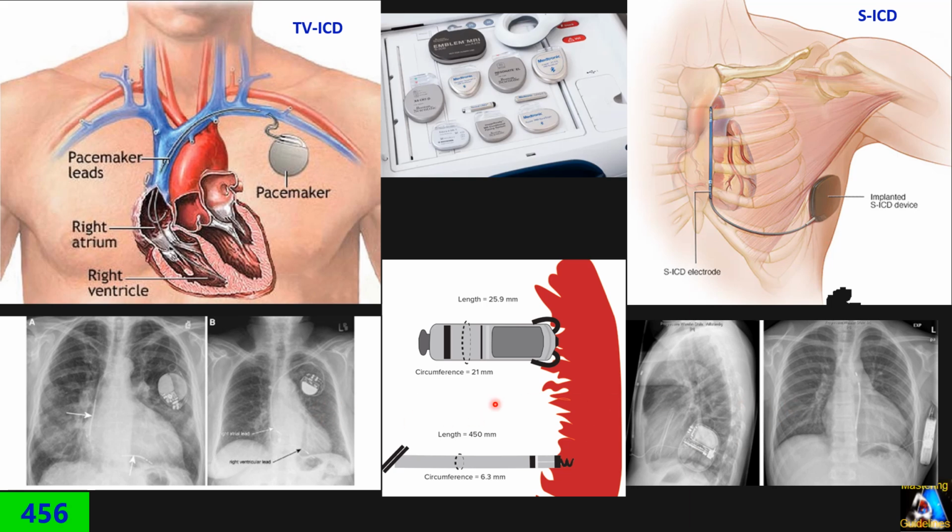All those ICDs and pacemakers are opaque, so we can see them on X-ray, but nowadays, especially the subcutaneous ones that I'm going to explain, they are compatible with MRI, especially in the last few years.